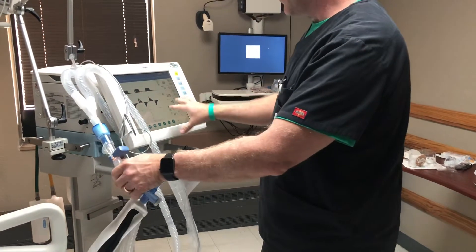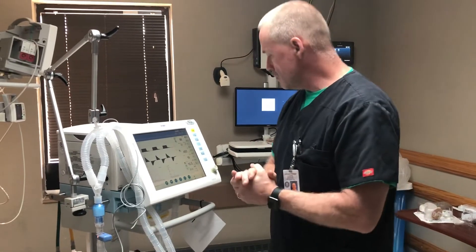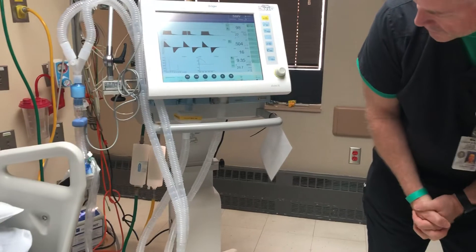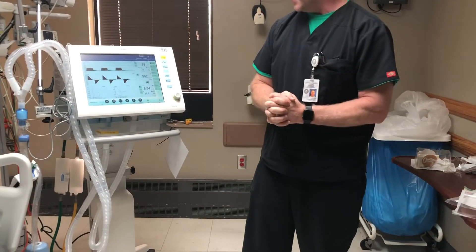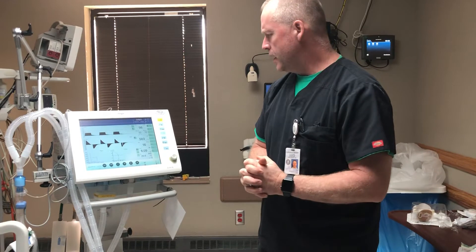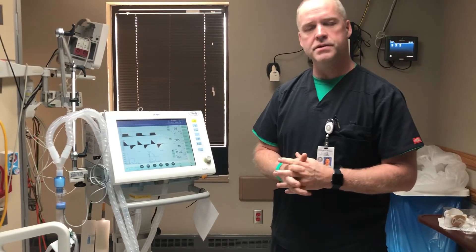Down here at the bottom is what's called the HEPA filter — the bacteria filter we use to keep everything inside for bacterial control purposes. This is the inspiratory limb. So this has been a quick overview of the Draeger XL — the settings, setup, and how to set it up quickly. If you have any questions, feel free to contact the respiratory therapy department and one of our expert respiratory therapists will answer your questions. Thank you so much.